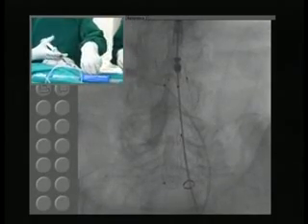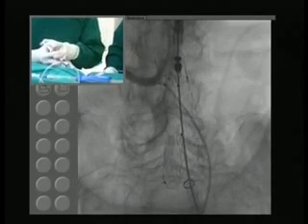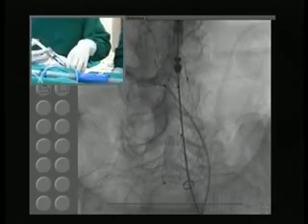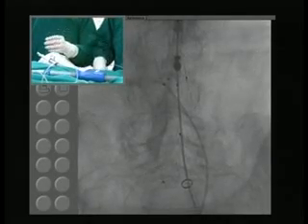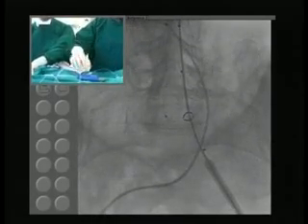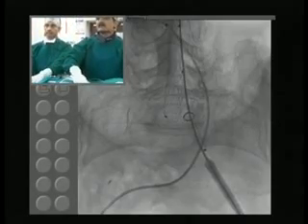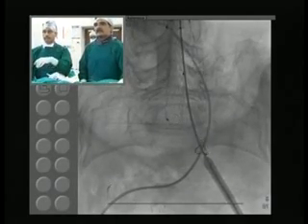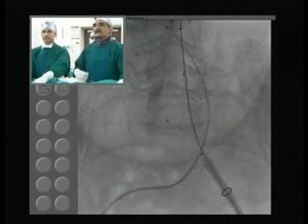Now one more angio just to be sure that the renal is flowing. Okay, so the renal is spared. And so now I'm going to complete the release. Show lower down, please. So at this stage I can do a quick release. Okay, so I've released the device and it's essentially opened within the sac of the aneurysm.